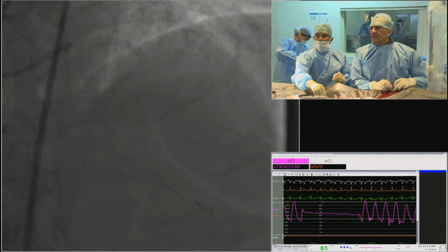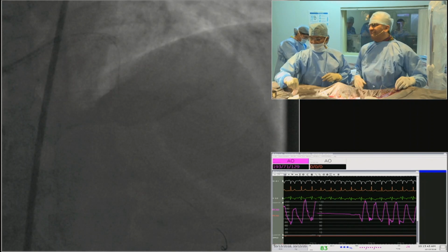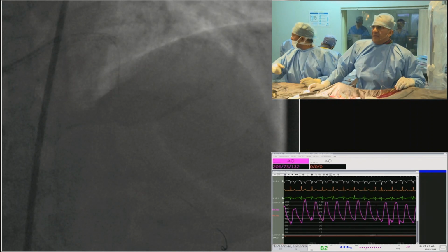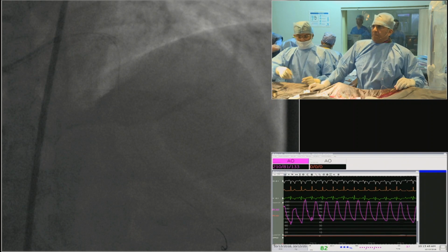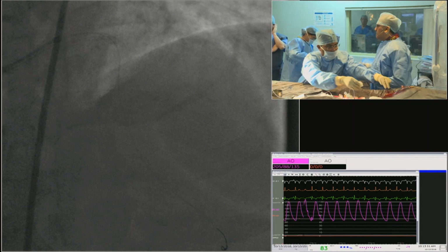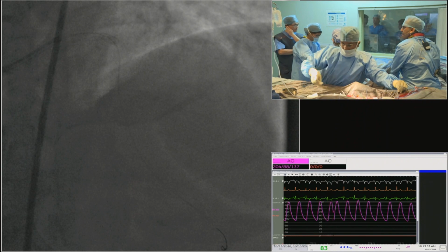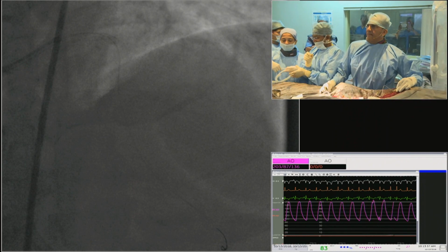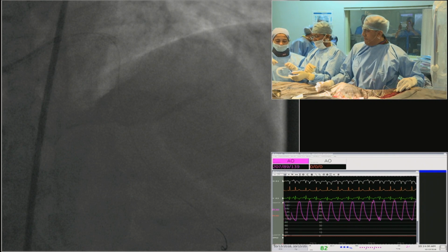Include the media, and we don't want 2.5 for a proximal LAD because the first stent is in the left main. I am very clear that no proximal LAD should be less than 3. In any case, I think he's using that as a dictum. I think 2.5 is undersized.